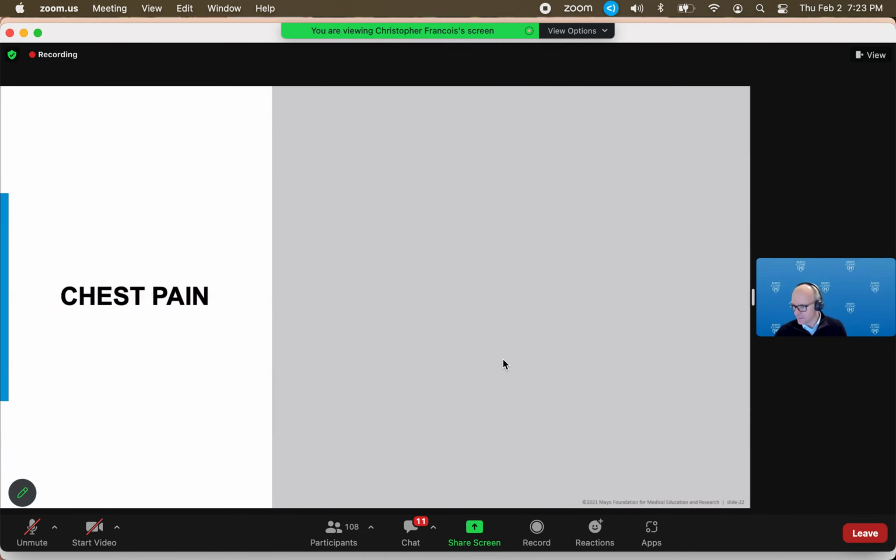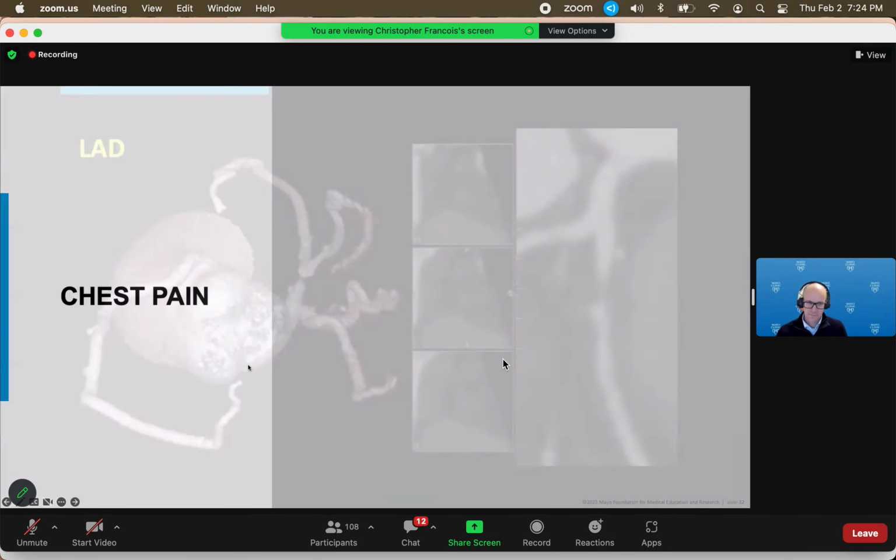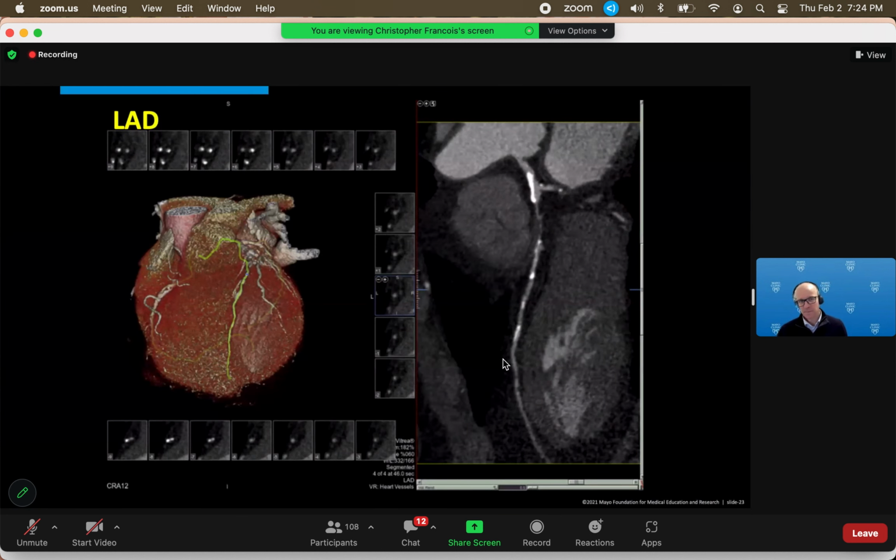Okay, next case. We've got Hawaii next. Okay. Hi. We have another. Yes. Let me get rid of my pen. Okay, chest pain.